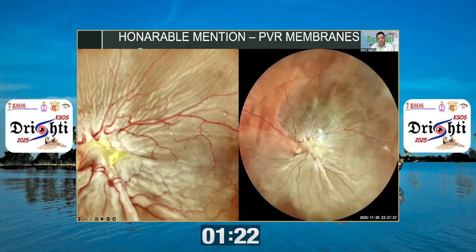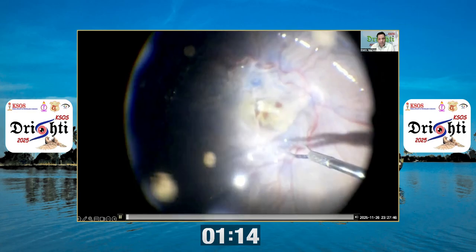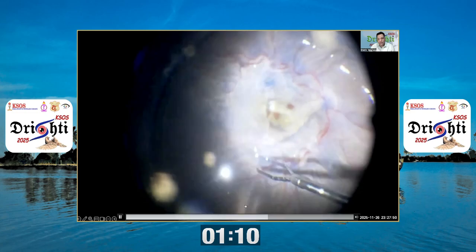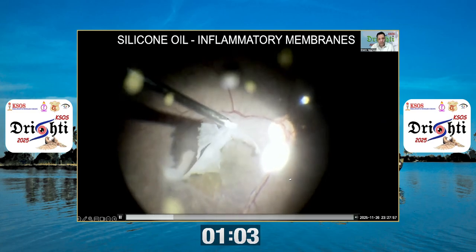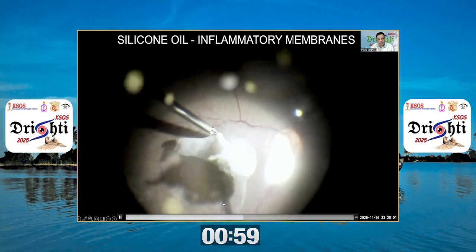And just a slide on some honorable mentions. Membranes can present at the macula in the form of proliferative vitreoretinopathy in cases with retinal detachment. Here you can see in this case, I'm removing these PVR membranes from the posterior pole. And another honorable mention: sometimes when you leave silicone oil inside the eye for too long, you can have these inflammatory membranes which develop.